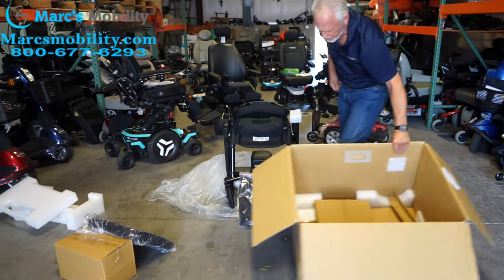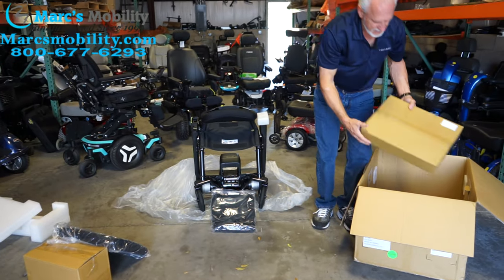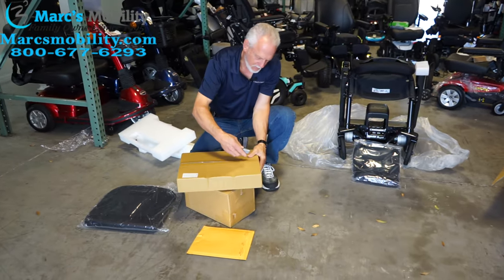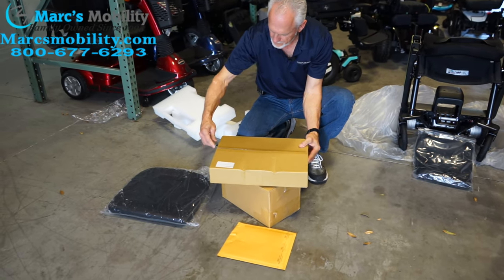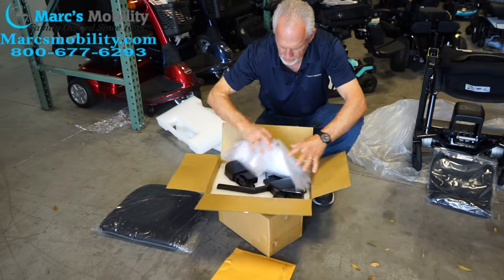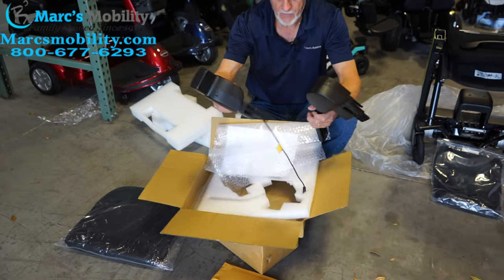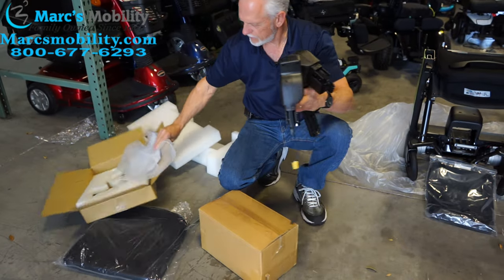So now, in the bottom of your box, you have another box here. Let's see what's in this box — these are probably going to be the arms. So in here is your joystick and your arms. Joystick and arms — we'll leave this over here for now.